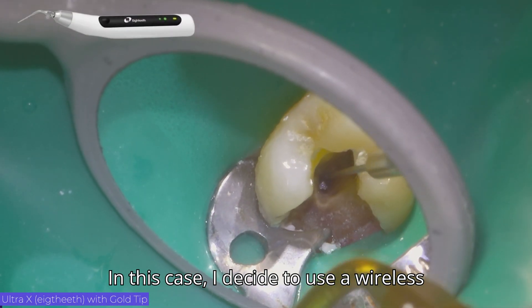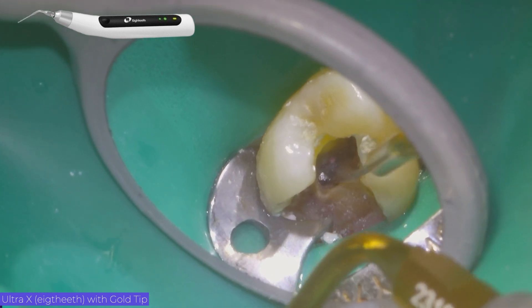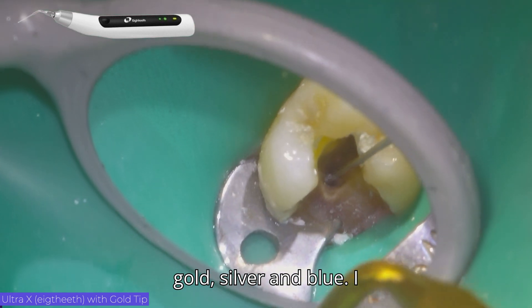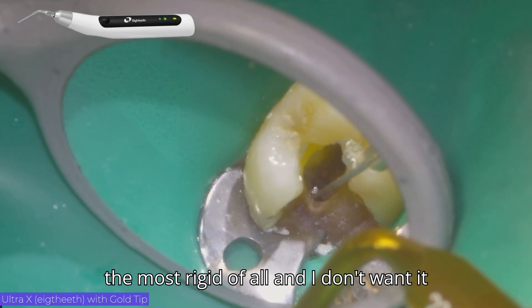In this case, I decided to use a wireless ultrasonic device called Ultra X. This device has three types of tips: gold, silver, and blue. I decided to use the gold one because it is the most rigid of all.